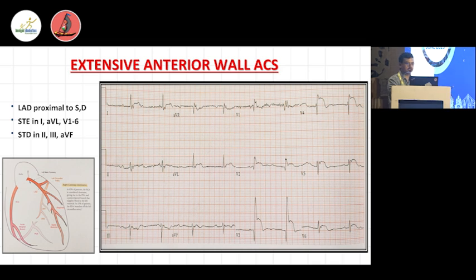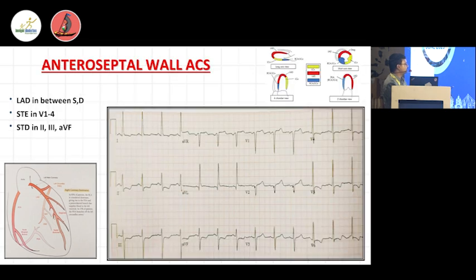With this background, we all know the basic pattern of the different ECG leads. The extra thing we should know is that to identify right ventricular infarct and others, it is important to take some leads on the right side also, reciprocal to the left side. These are V2R, V3R, V4R, V5R at the same level, but exactly on the right side.